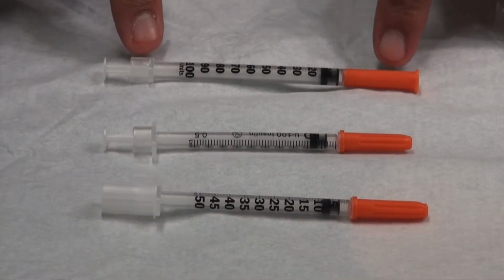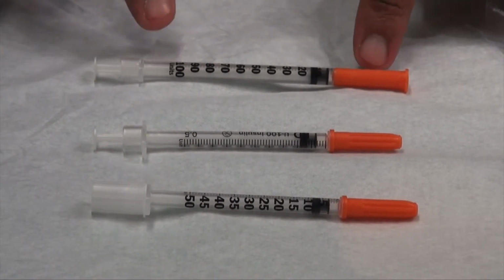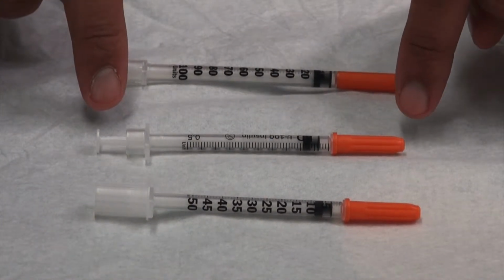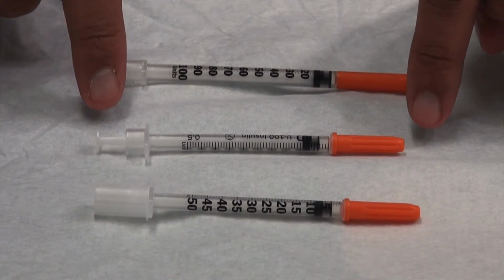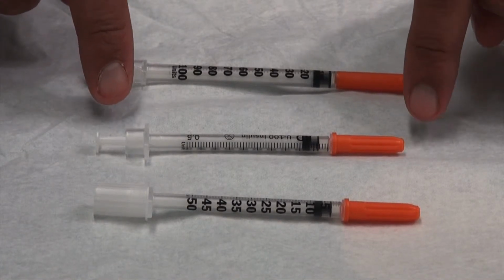The 1 ml insulin syringe comes with a needle that is 12.7 millimeters long and a 29 gauge in width. The 0.5 ml option also comes with a 12.7 millimeter long needle and also has a 29 gauge width.